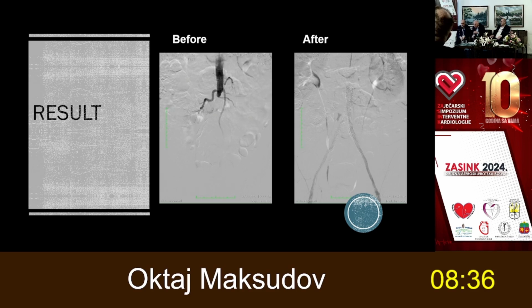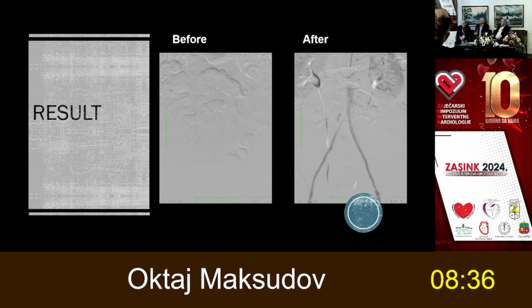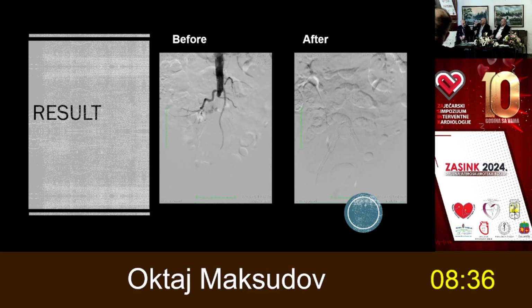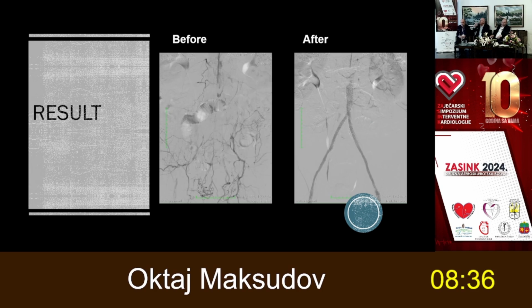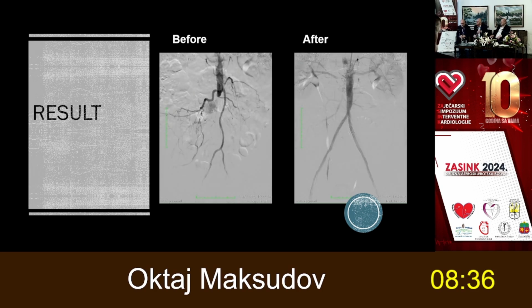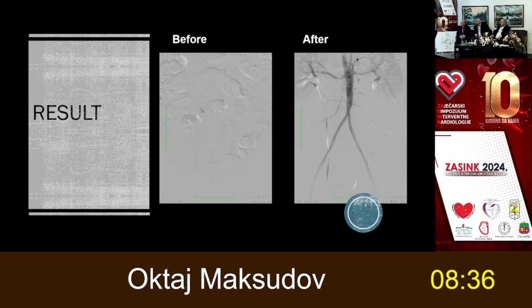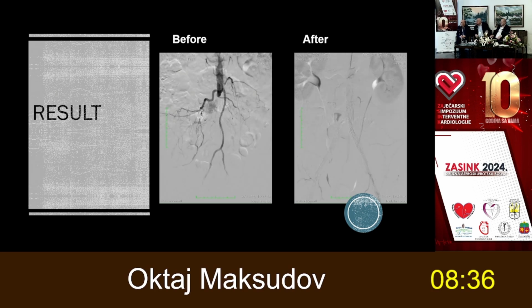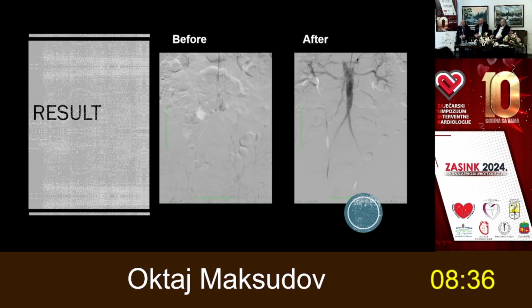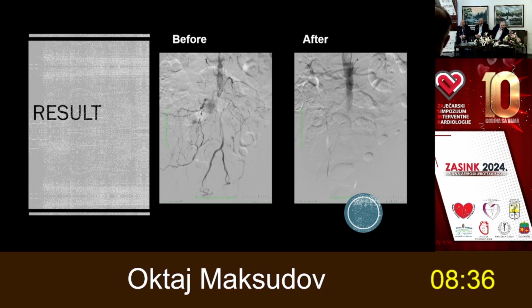Because my patient is paralyzed on the right side, she didn't flex her right leg. And I don't want to spend half an hour pressing, deflating, inflating, and so on. So I would like to finish this case in early Saturday afternoon as fast as possible. Yeah, that's the fastest way.